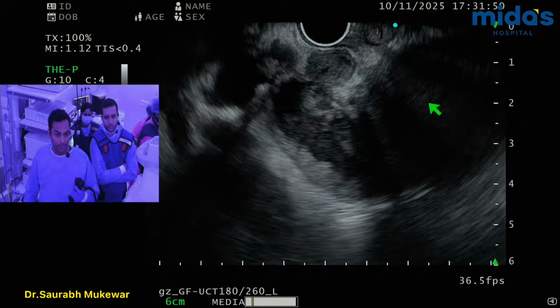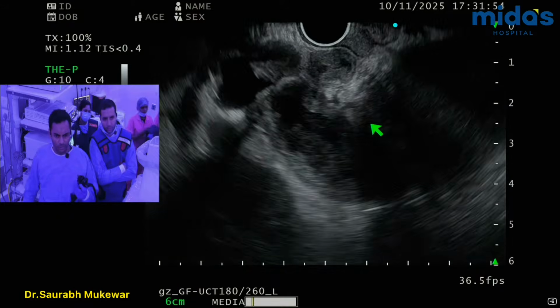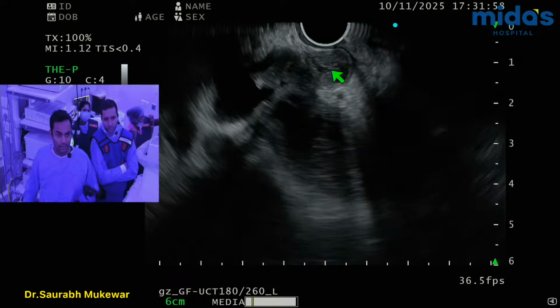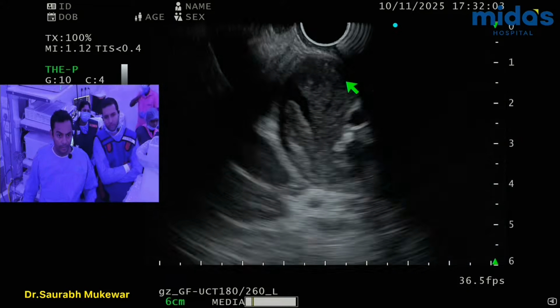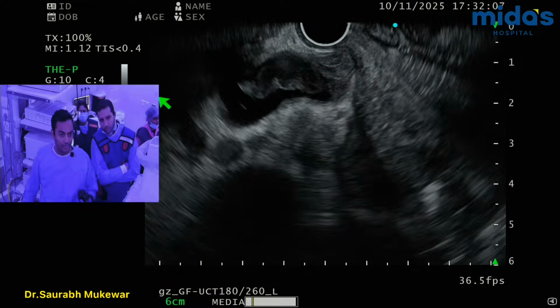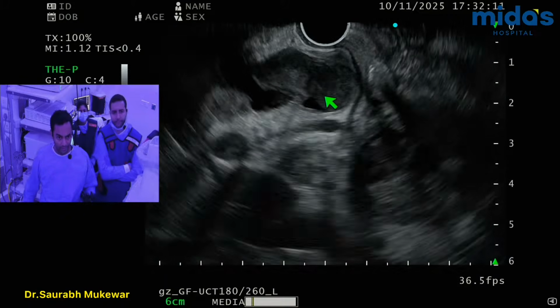So this is your gallbladder. This is a thickened wall of the gallbladder. Interesting. It's almost cholecystitis like. And then this is your cystic here, I'd say. And then it would kind of open into the bile duct. So this is the bifurcation of the ducts, and this is the liver. And what you can see is a large amount of sludge in the bile duct, right?